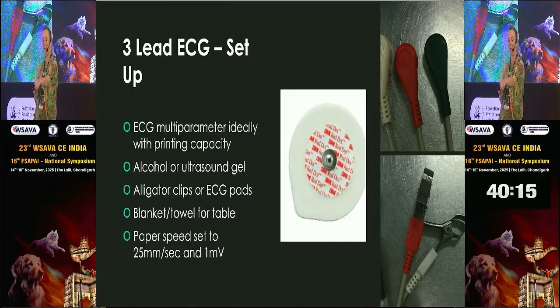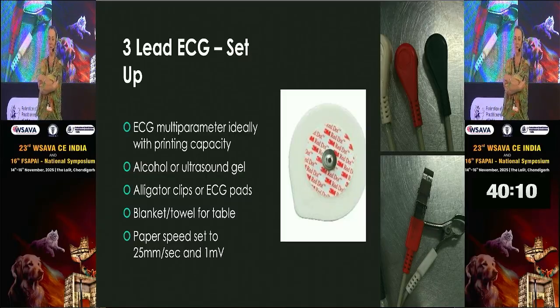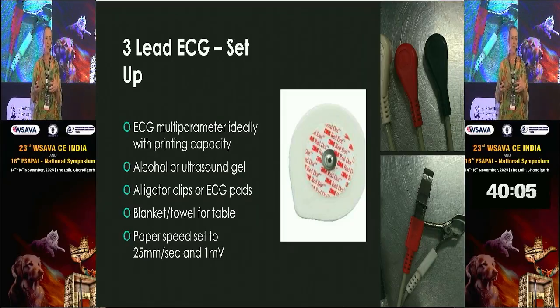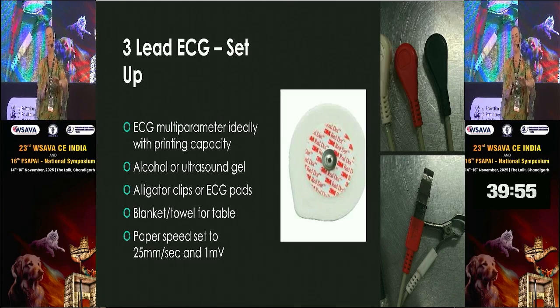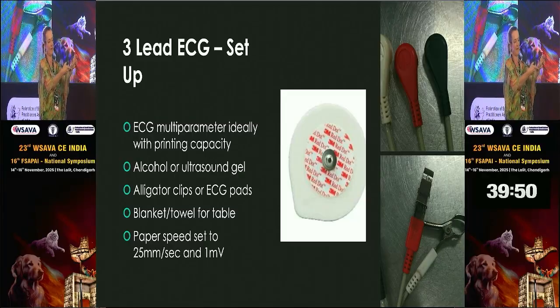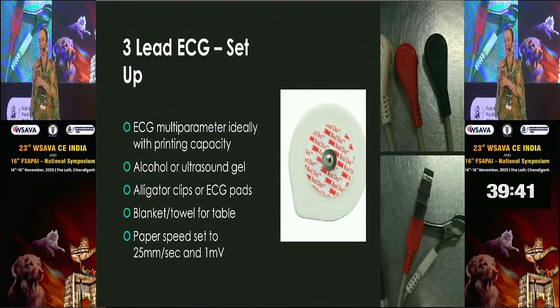We use the little dots, if they're in a crash patient and it's an emergency, we clip on, and you'll find the clips. We can just go behind each elbow and on the flank on the left. If we want it to stay on a little bit longer, we'll clip the hair. You can put it directly on the pads if they're not recumbent and not walking. But as soon as they get up and start walking, they really hate things on their pads. So we actually just clip the hair from the pad up, and we stick those dots on, and then you put a little bit of Coflex or the vet wrap, and that keeps the buttons on.